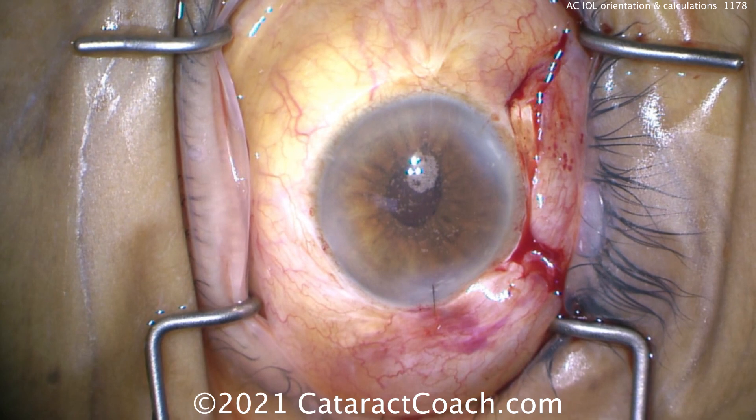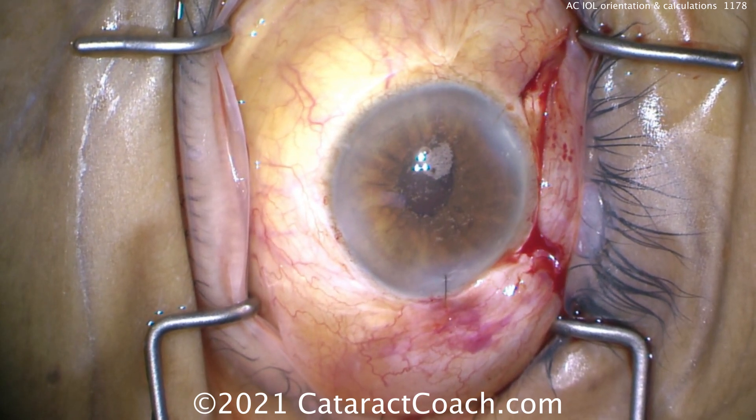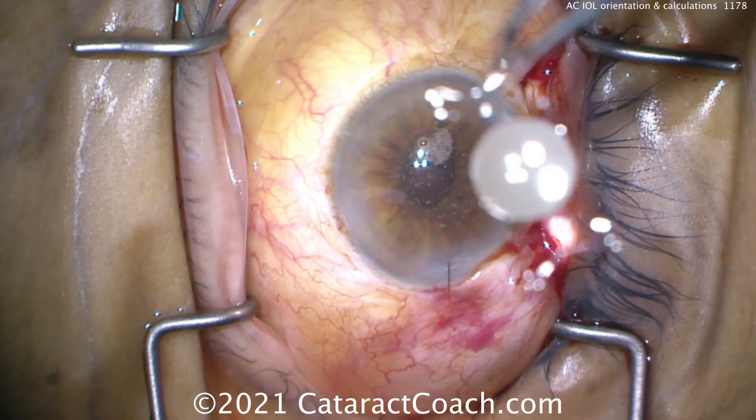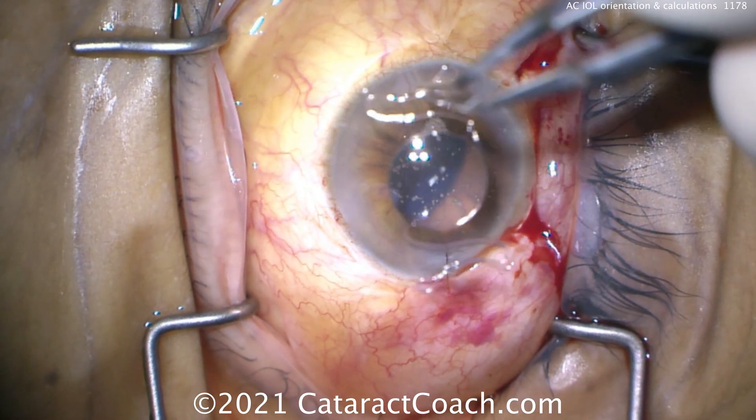What's the correct orientation? The first thing is: I've closed the main faco incision. There's a suture in it, because you don't want to use it. Do not enlarge the faco corneal incision to 6.5 millimeters in order to fit the AC lens in. Make a separate scleral tunnel like we've done here.